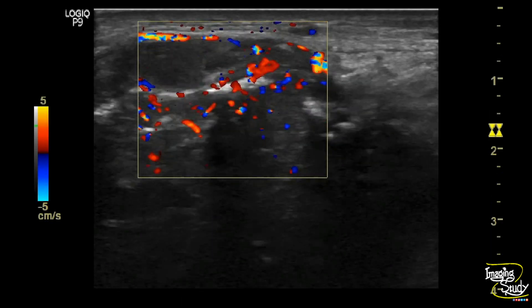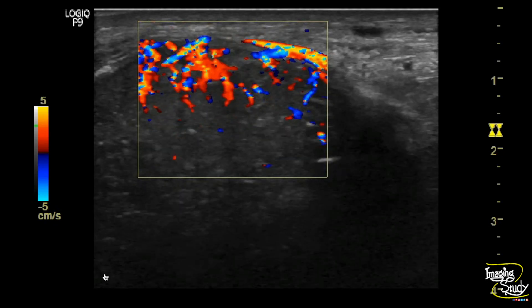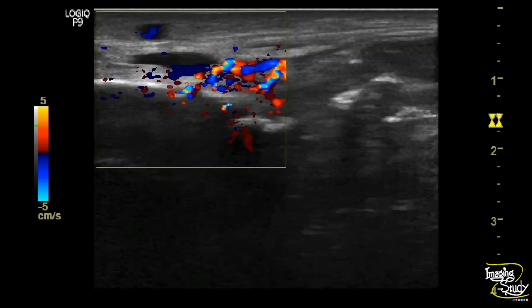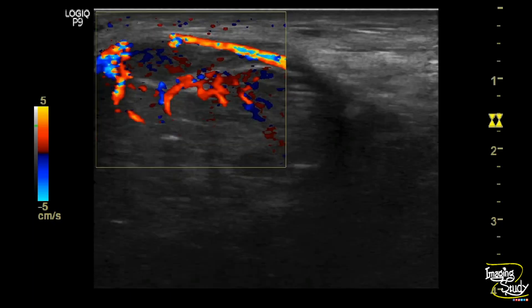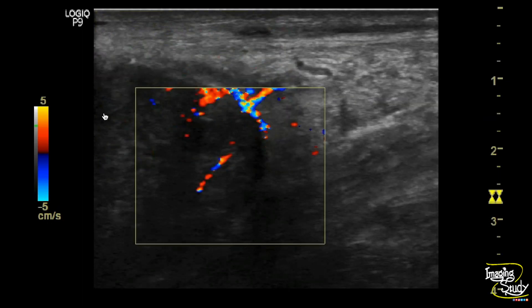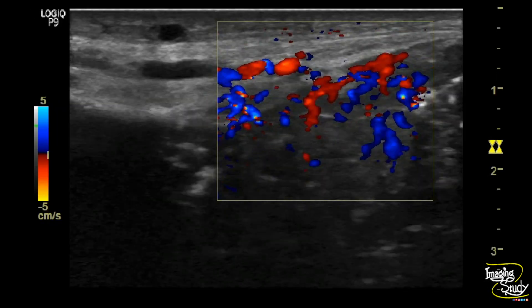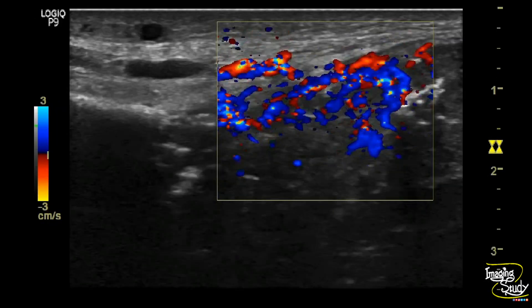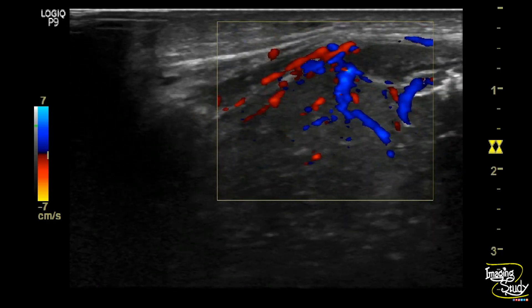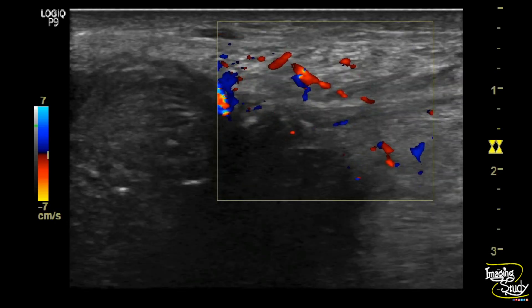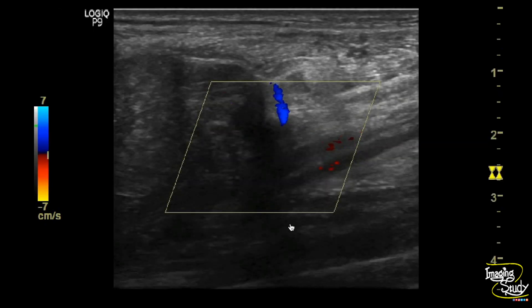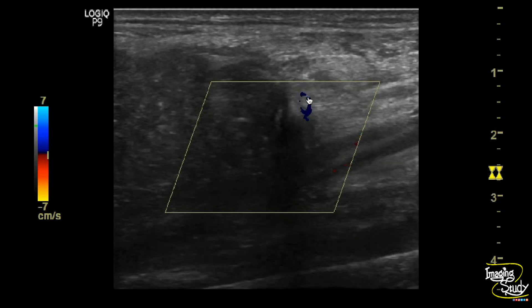To evaluate further, we used color Doppler ultrasound, and you can see it is an extremely vascular lesion. Two months back, when this patient had an ultrasound of this soft tissue mass without any bony destruction, it appeared like an arteriovenous malformation. But now you can see this vascularity is towards the soft tissue lesion, and when we trace the origin, the main feeding artery is arising from the posterior tibial artery.